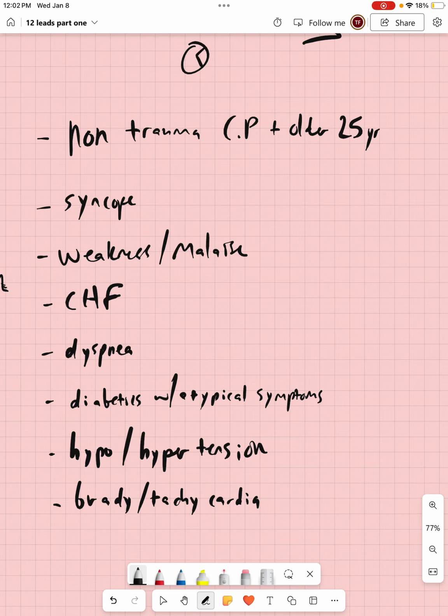That's great that we're doing a 12 lead, and it's great if we can read the 12 lead, but we are not the doctor and we're not the cardiologist. We're not the specialty care team that is in place for this patient. After we're done with them, they're the ones who need to see this information most. And so, when we transmit that 12 lead, very often it is sent immediately to cardiologists and cath labs, and doctors start doing things right away.